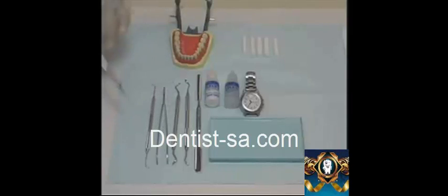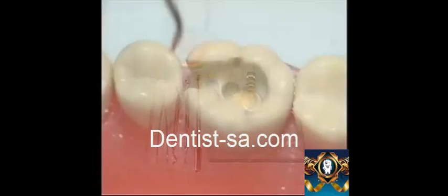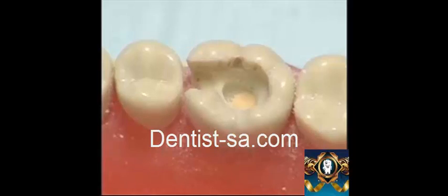You also need cotton pliers, an explorer, and cotton rolls. Before placement of zinc phosphate cement, we cover the deepest part of the pulpal floor with calcium hydroxide to prevent the irritating effects of phosphoric acid from damaging the pulpal tissue.